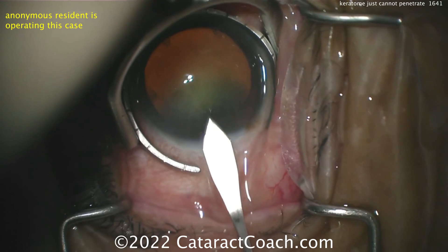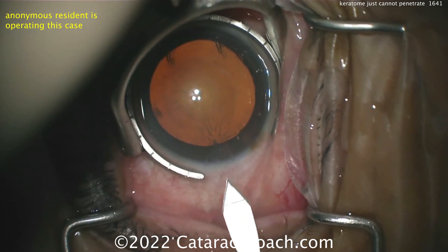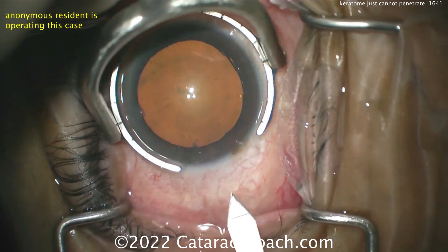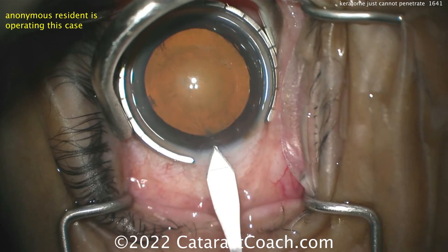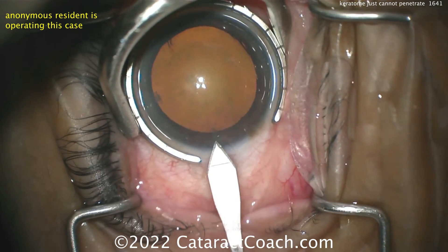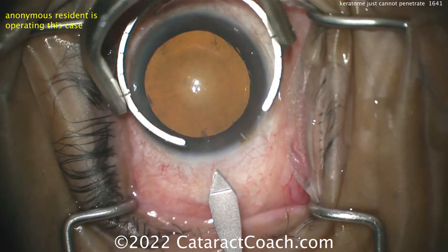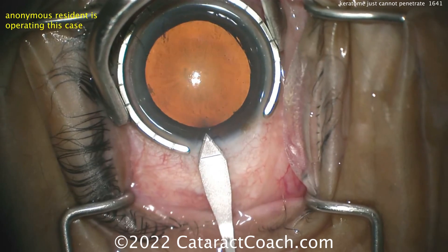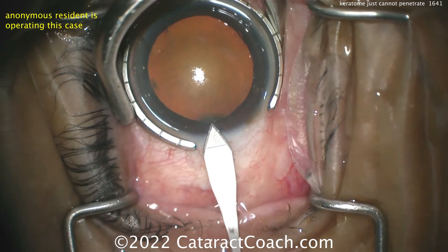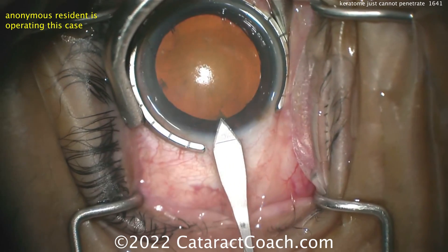So let's watch carefully. Trying again with that keratome — maybe you just need a little more force. So let's line it up again and now make sure you're in the same plane, the same path. You don't want to create a separate path. Slight wiggling of the blade left and right can help you ensure you're in that same initial pocket. You can see the tip there in the red reflex. The tip of that tunnel is triangular in shape.